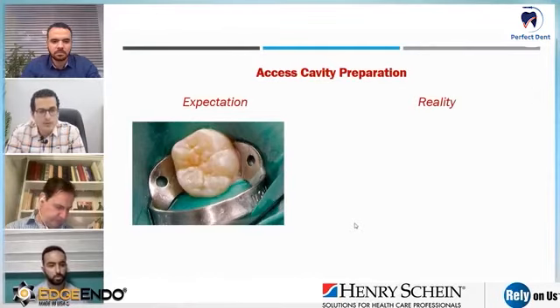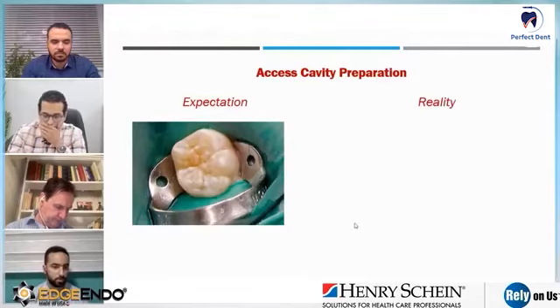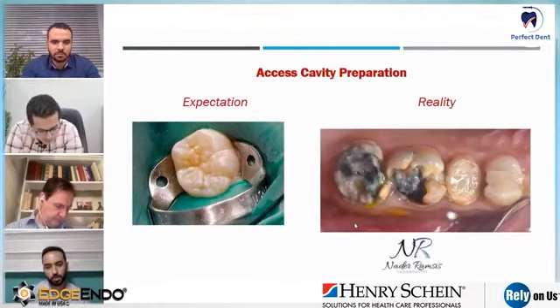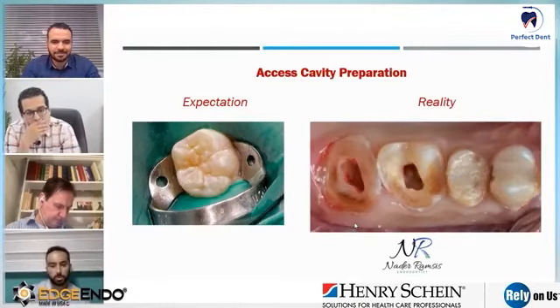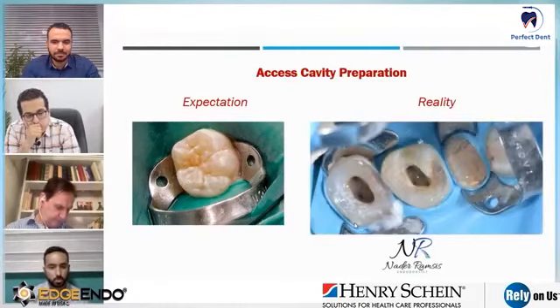How often do you encounter such a perfectly sound molar, so you can choose to be conservative or not? Maybe you can encounter this with a periendo lesion, maybe in trauma, maybe in a molar that needs an intentional root canal treatment, or if it's over-erupted, for example. But that's not our usual daily practice. We usually don't have the choice. So maybe this case is a little bit extreme, but what you should do is do your best to preserve the tooth.